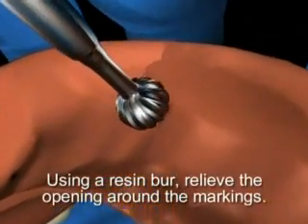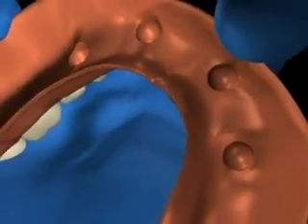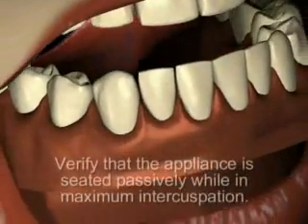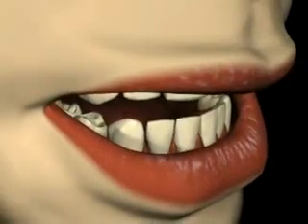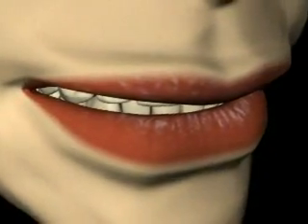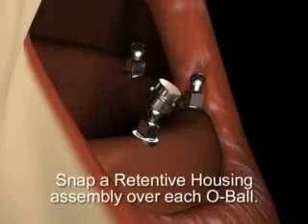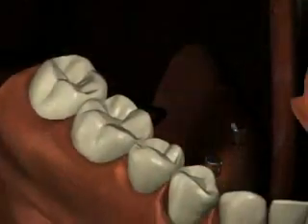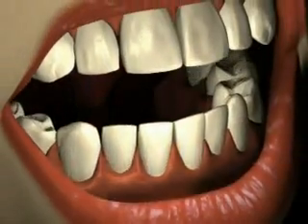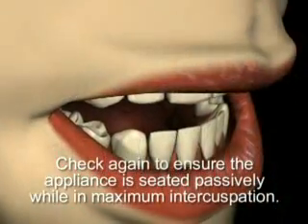Using a resin burr, relieve the opening around the abutment impressions or markings in the denture by approximately five millimeters. Try the denture in the patient's mouth and verify that the appliance is seated passively while in maximum intercuspation. The o-balls should not touch any part of the denture.